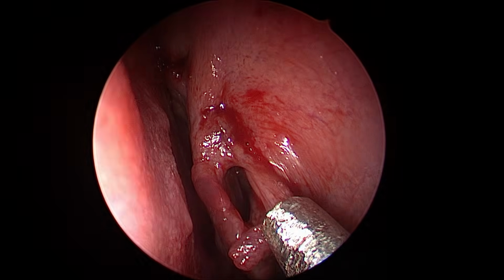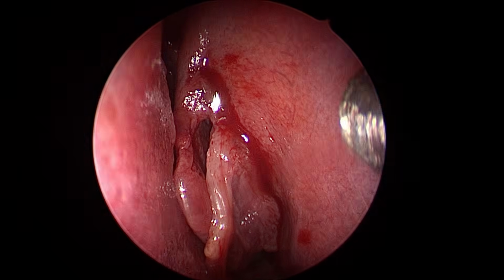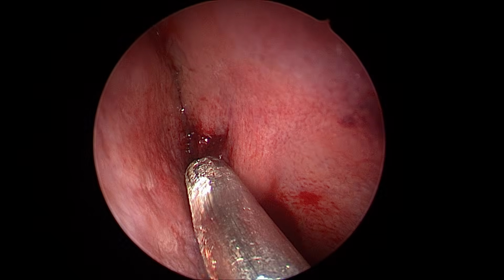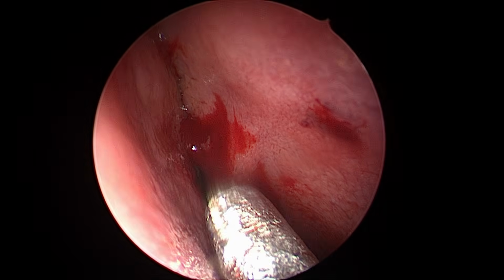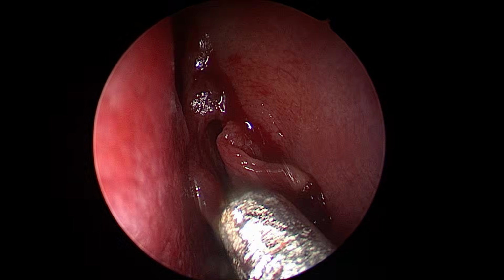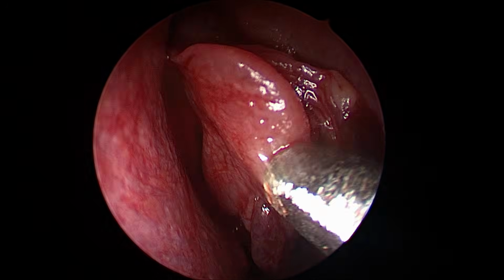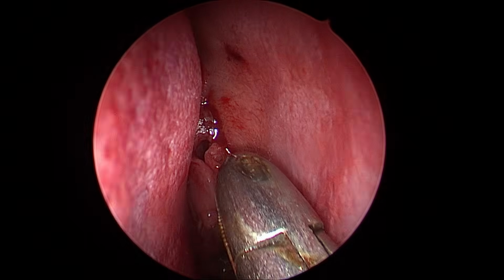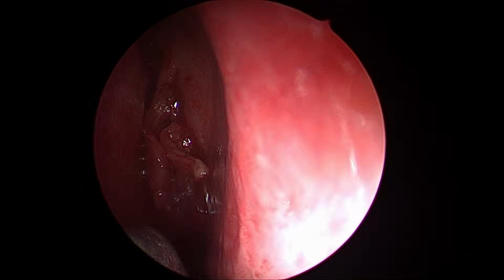Once you have polyps medial to the middle turbinate, one thing should click in your mind. Number one, such patients present with olfactory symptoms, olfactory loss. Number two, in such patients the middle turbinate is floppy. See this? Yes, sir. Once you have polyps coming from the medial side, it makes the middle turbinate floppy, and if you don't treat it, the untreated turbinate itself can become a big cause of failure.